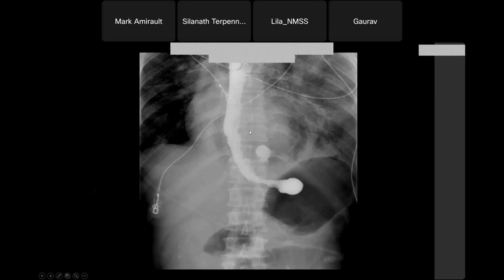And even though we know this guy has an esophageal rupture based on the CT, we'll have him get an esophagram. And this patient has swallowed contrast. This will be water soluble contrast because we suspect a rupture. We don't want barium contrast to be stuck in his mediastinum. So this water soluble contrast, you see this should be a nice smooth contour like up here. And this is a perforation. So confirm the perforation with a fluoroscopy.